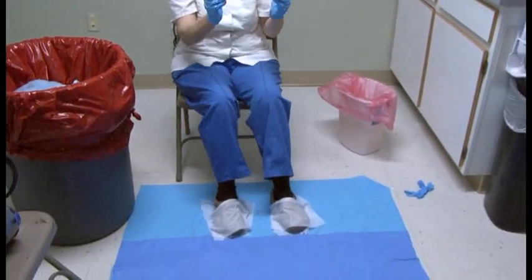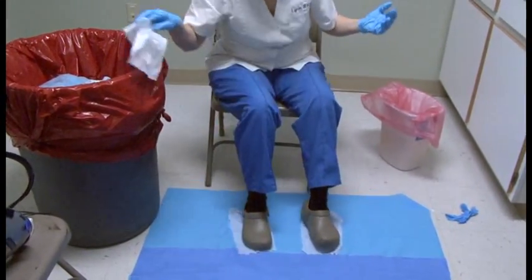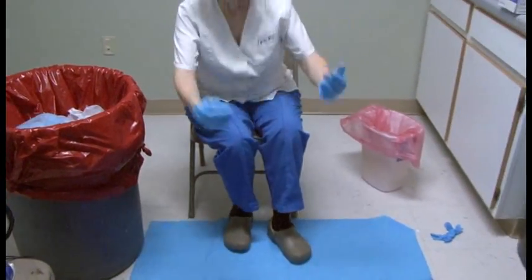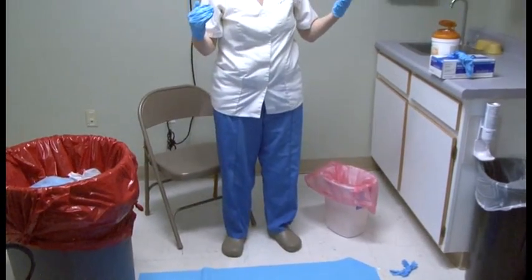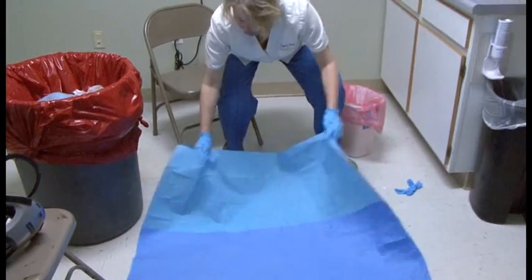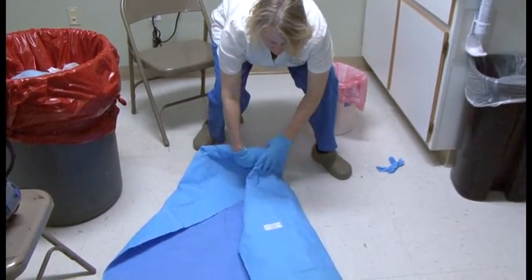When the four minutes are up, Lynn throws away the wipes, steps off the doffing pad, and rolls the doffing pad onto itself without aerosolizing it. The rolled pad then goes into the garbage as well.